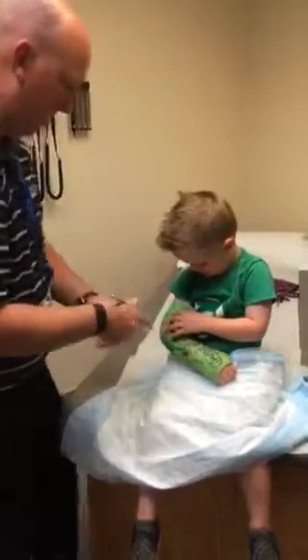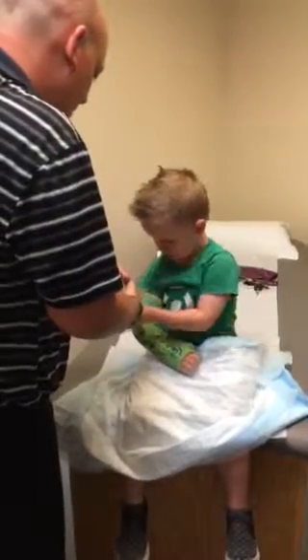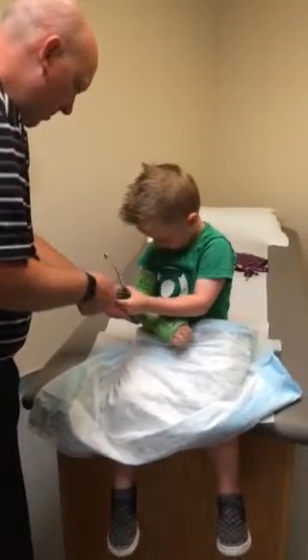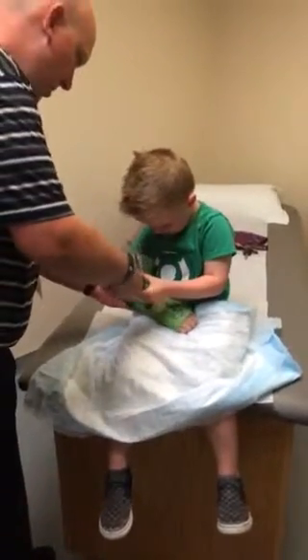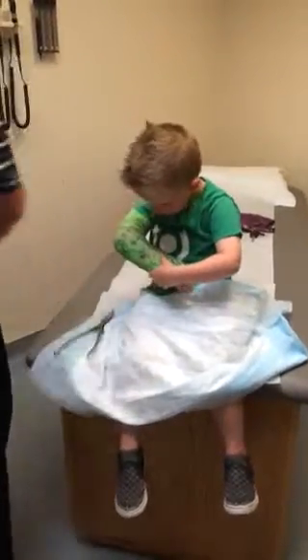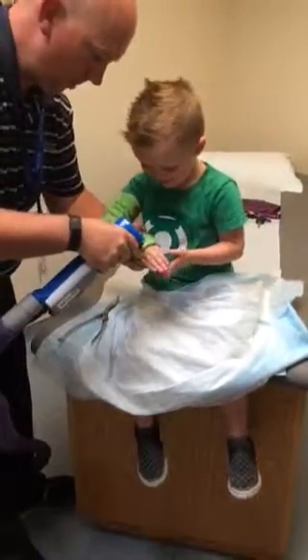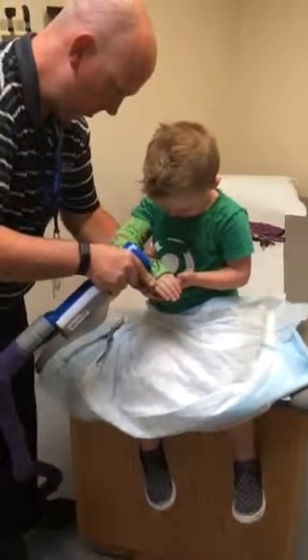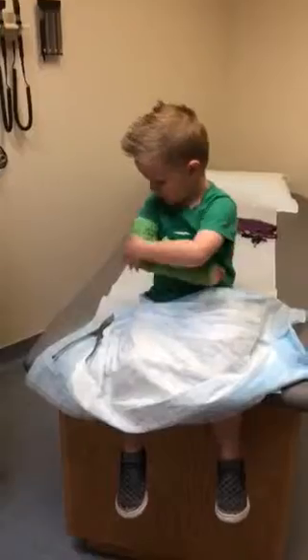Oh my goodness. Now we've got to do it like three times. You help me squeeze. Okay, you open your own cast. Let's see if we can crack it — set, squeeze. Almost. I almost got it. I'm going to do one thing — I'm going to miss a teeny spot. Let's see if we got it that time. I still count it on. You have to have this awesome tool.